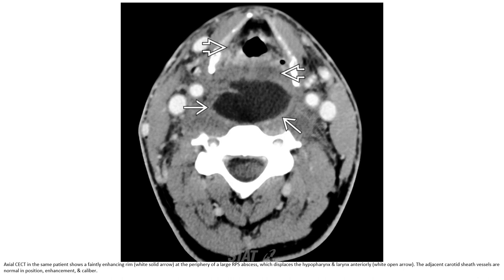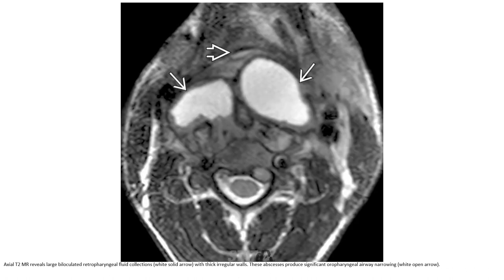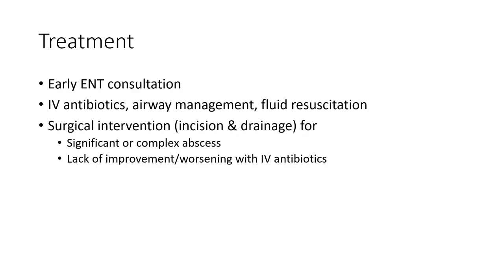Same patient on CT. There is a rim-enhancing retropharyngeal space collection which displaces the hypopharynx anteriorly. The adjacent carotid space vessels show normal enhancement and caliber. The fluctuant retropharyngeal collection at the C2 level with surrounding edematous bone indicates abscess causing significant airway narrowing and requiring treatment.